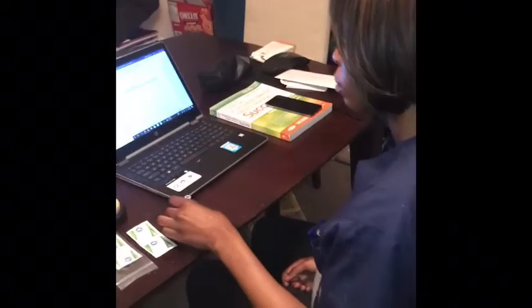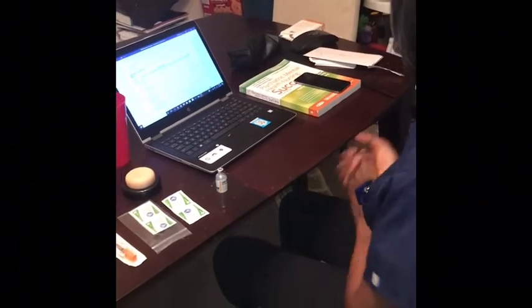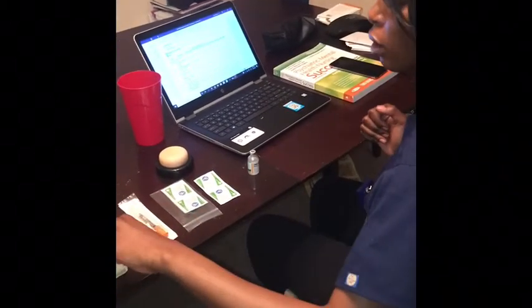So the next thing I'm going to do is look into the vial. This is the vial I'm going to be using. From here, I'm going to put my gloves on. I already washed my hands prior.